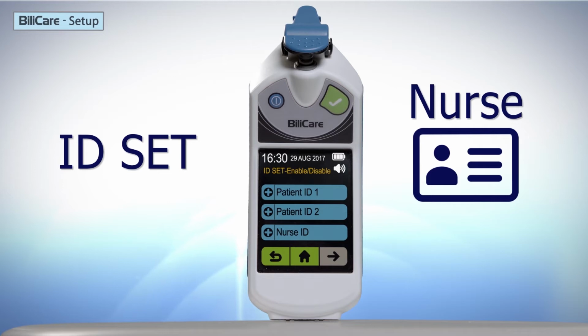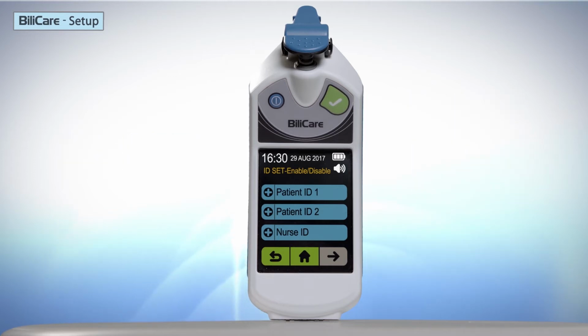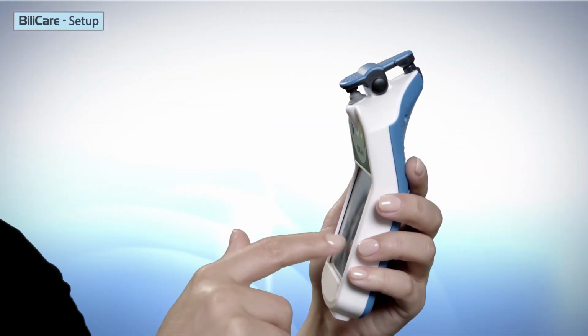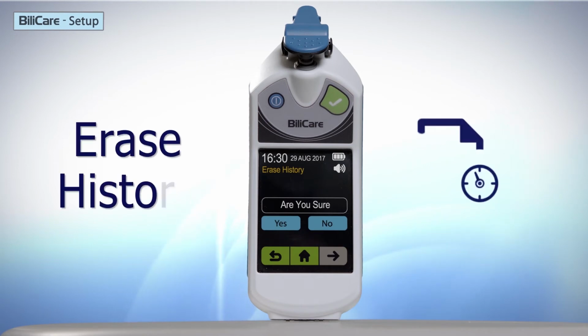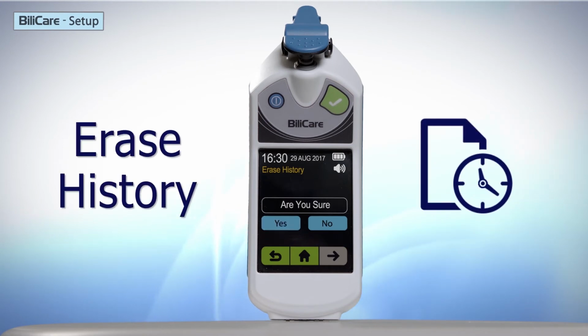The plus sign shows that the ID was selected, while the minus sign shows that the ID was not selected. Pressing on the ID changes the selection status. Any combination of these IDs is suitable. The Erase History menu deletes the results stored in BiliCare's memory. Yes will erase the data.